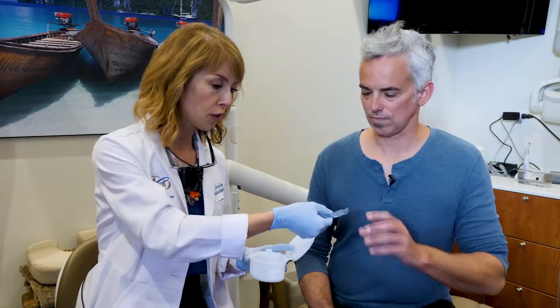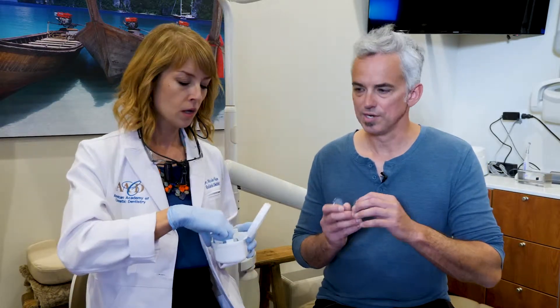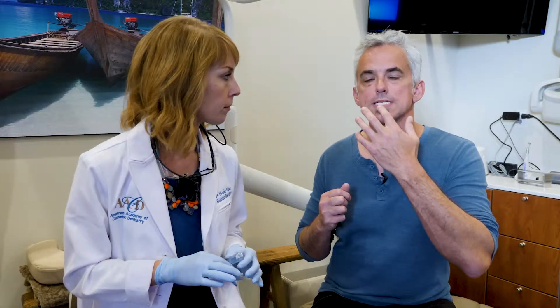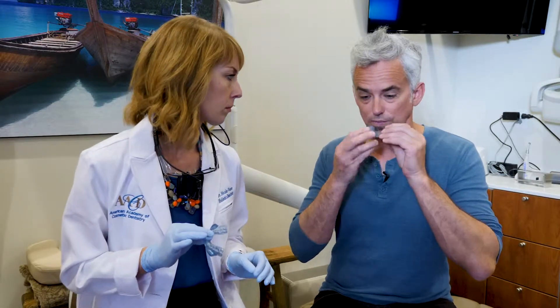These appliances also help with snoring because by advancing the lower jaw forward they keep the tongue from falling back, so it accomplishes two things. You can even try it at home by sticking your lower jaw out a little bit and trying to make a snore sound — it's really hard to do. That's kind of what these appliances do.